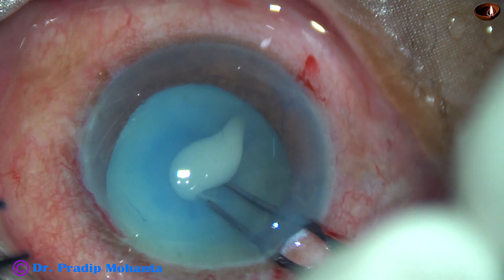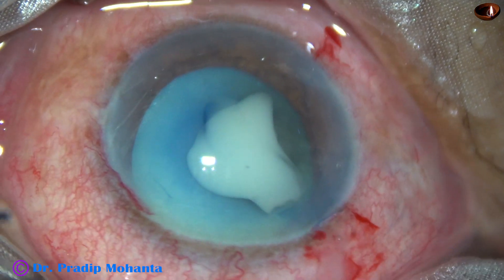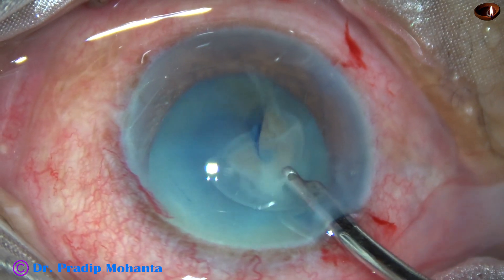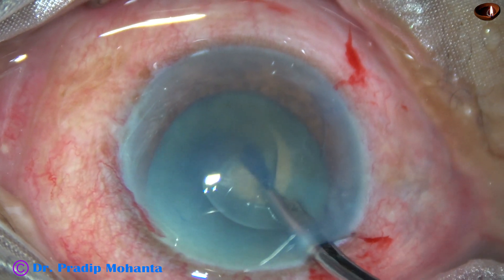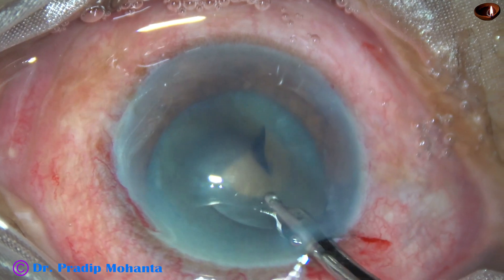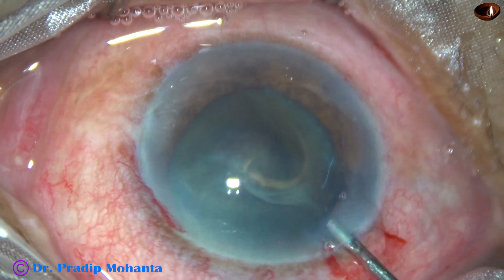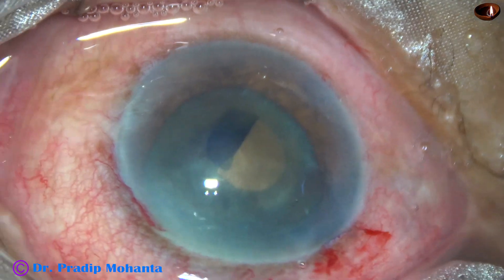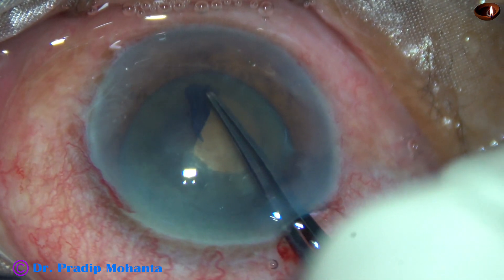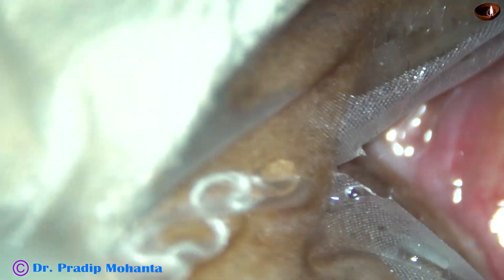I have taken the capsulorhexis forceps, hold the tag and go for a distance. But I cannot see well, so I stop here and aspirate the milky fluid. As soon as the milky fluid has come out, the intralenticular pressure is normal, and we can see a hard brown nucleus. So I am trying to make a slightly larger rhexis.